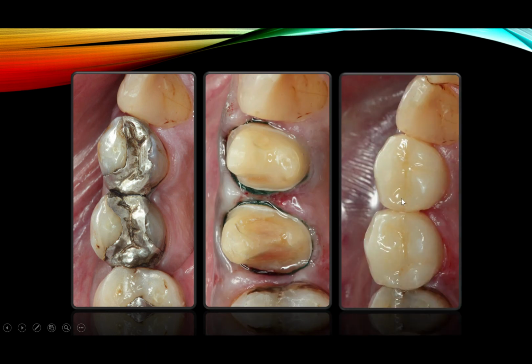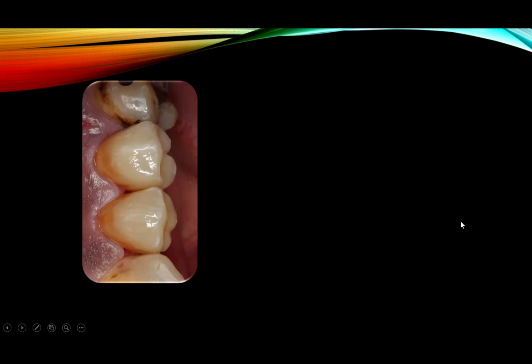Look at these two crowns, premolars, prepped, cemented. All right. Now these premolars had zero porcelain in them. Was fully pressed, contacts, adjacent occlusal points and contacts. Everything was established with wax. You press, you just finish, and then you glaze.